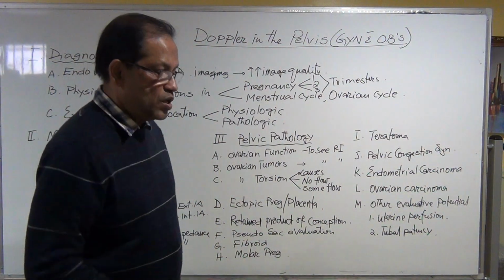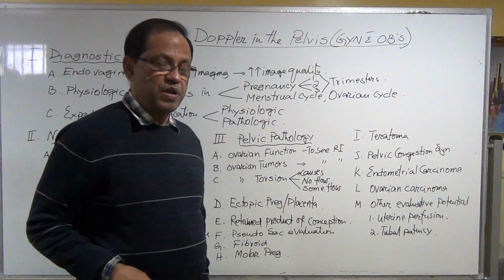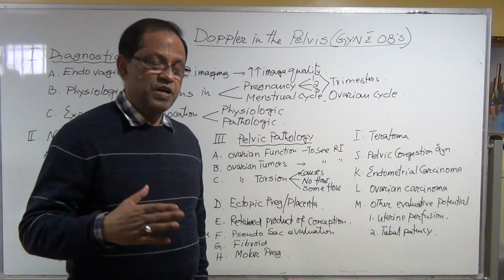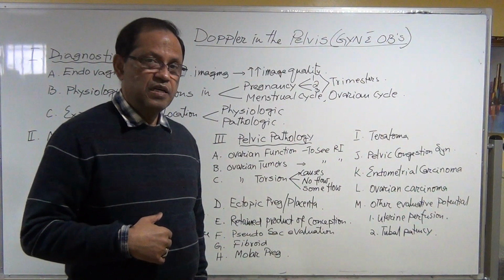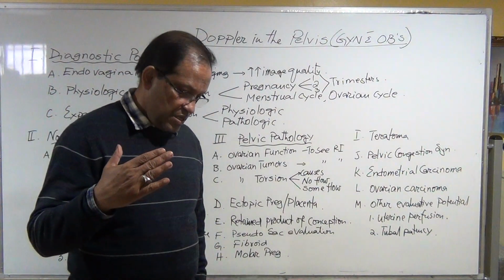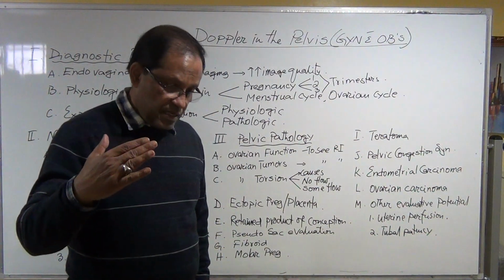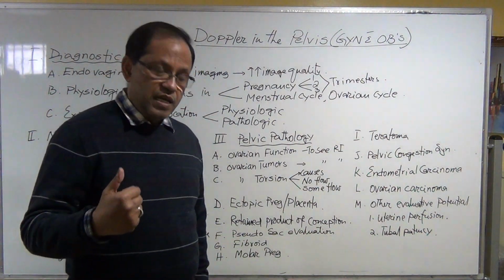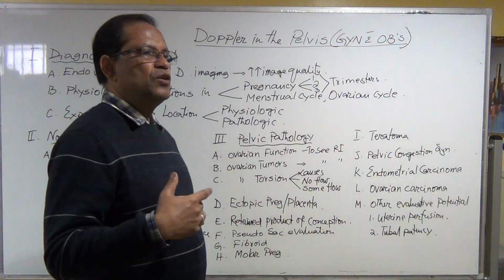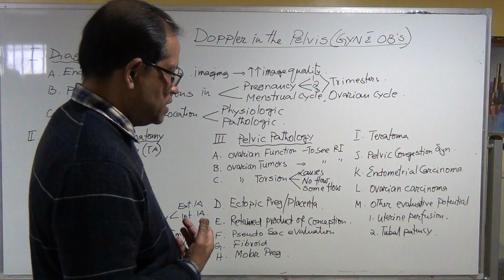And it's not during the pregnancy, first trimester pregnancy, second trimester pregnancy. Usually we do first trimester and we figure out whether the pregnancy is in trouble or not. If there's a problem, the doctor will do the proper management.